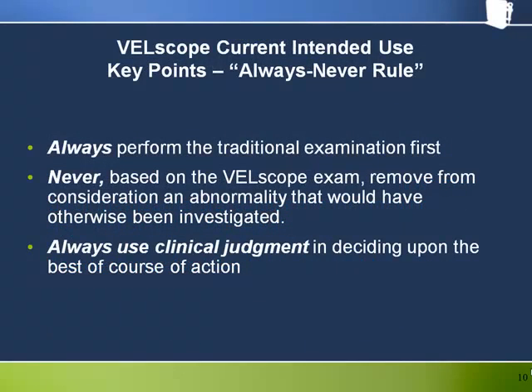The FDA likes to consider the so-called always-never rule when they clear or approve adjunctive medical devices. In this case, this isn't just regulatory red tape, but comprises a great deal of wisdom. Before you use the VELscope, always perform the traditional extra and intraoral head and neck exam first so that you can formulate an unbiased appraisal of the clinical situation.